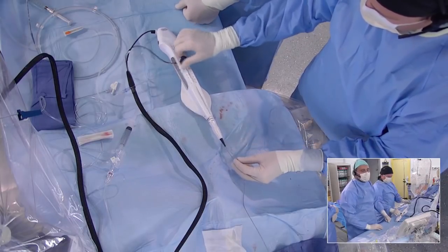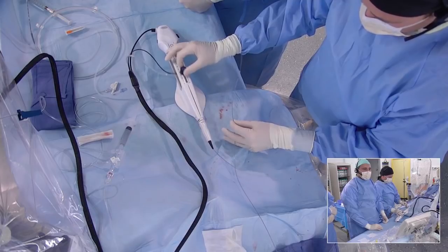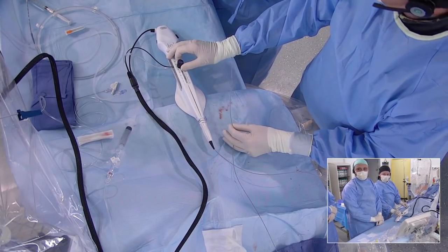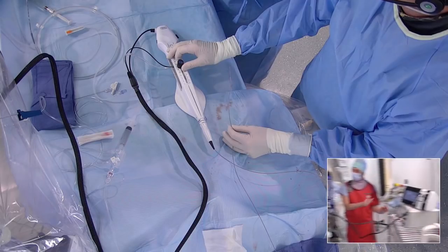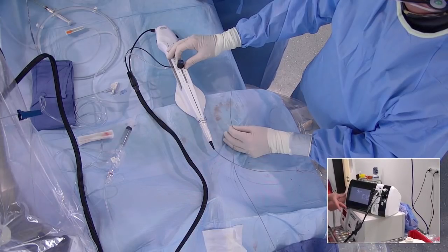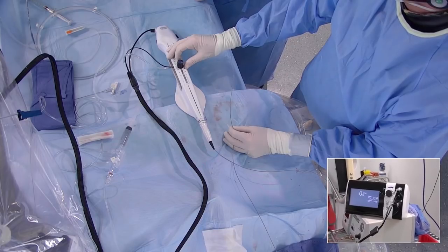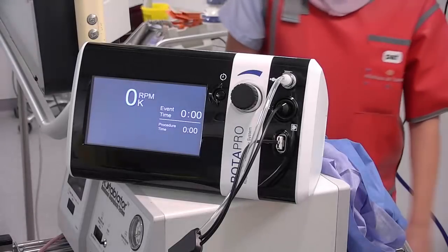It might be worth seeing now the system with the connection. By turning the camera a bit towards the console, there you go. So you see the system, the three cables, and the air cylinder that is just hidden behind, but everything is there. And the beautiful thing is that there is nothing on the ground. No pedal. Everything is on the table now.